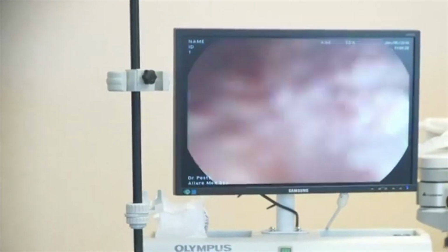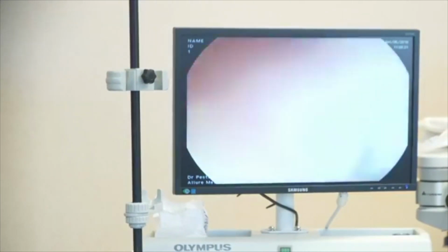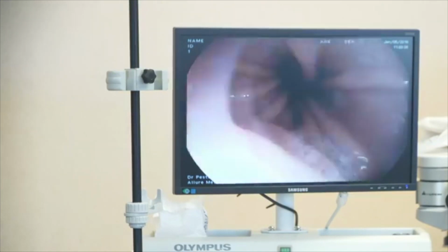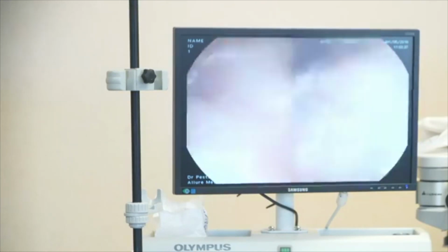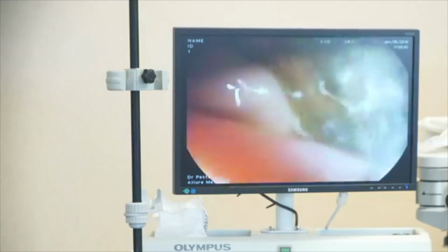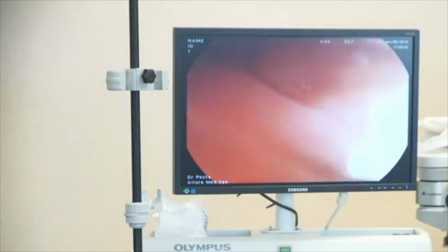we get to the bottom of the stomach, and now we look inside. Like I said, hiccups are common. We look for other issues that may prevent placement of the balloon. Her stomach looks appropriate for placement, so we'll get started.